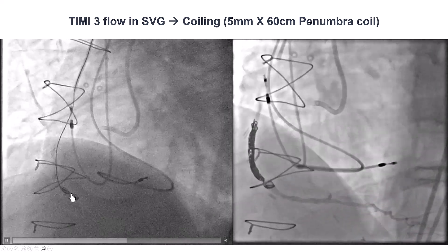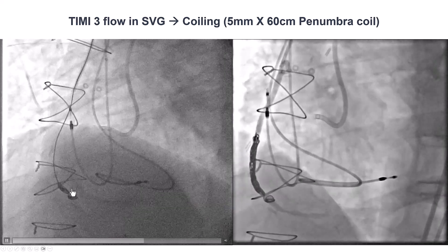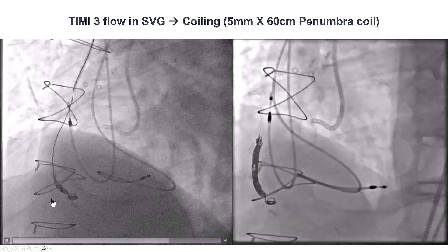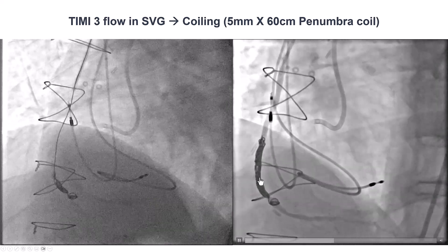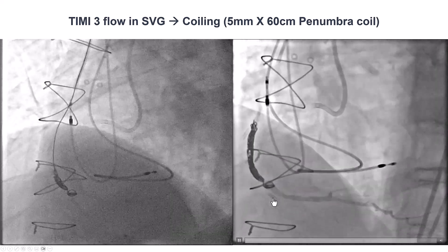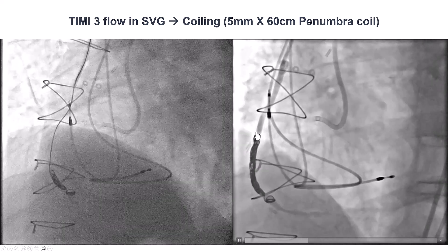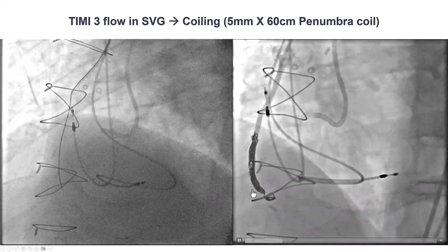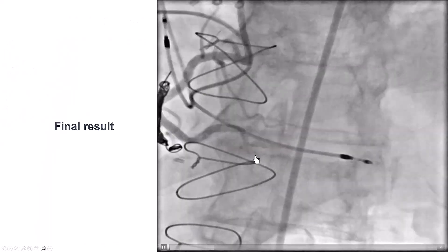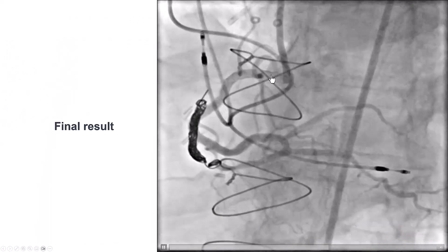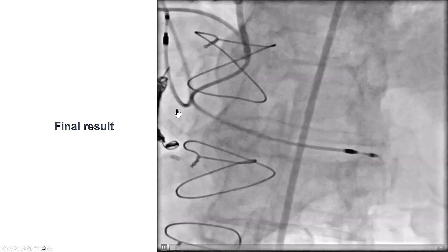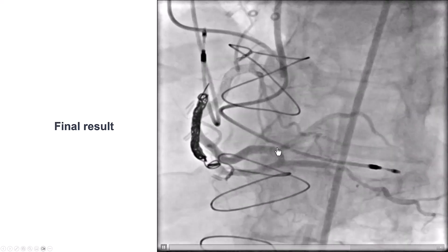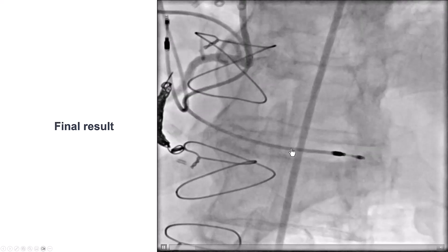We then decided to close the saphenous vein graft because of significant competitive flow. We placed a long coil into the SVG. Although the graft was not completely closed immediately, it will close once anticoagulation is reversed. In the end, we had a successful result: the RCA was successfully re-canalized into the PDA, with good flow also into the right posterior lateral.